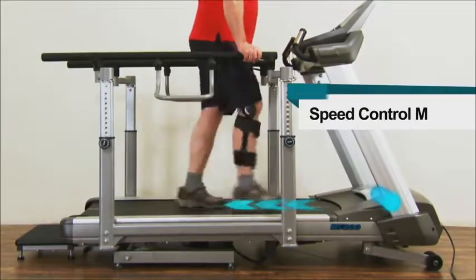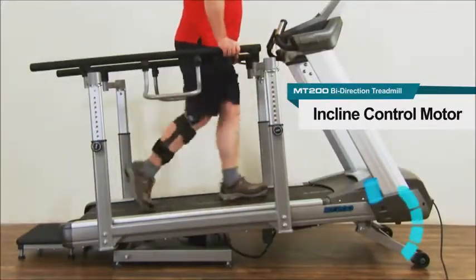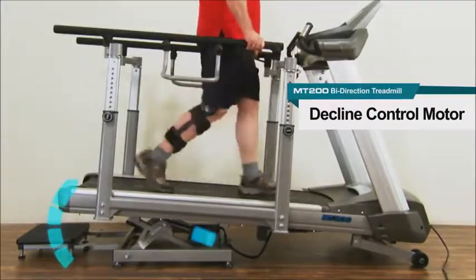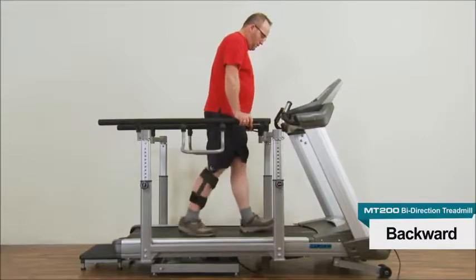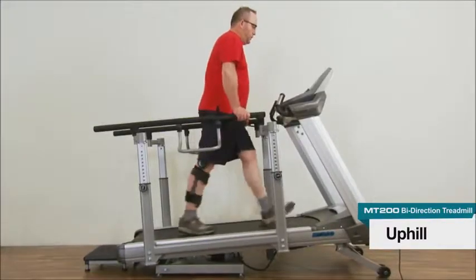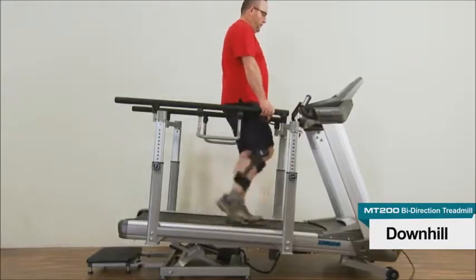The MT200 has three motors: one for forward and reverse speed control, one for incline from 0 to 15 percent, and one for decline from 0 to 10 percent. The three motors provide a variety of environments for training different muscle groups. Users can walk or run downhill or uphill in either the forward or the reverse direction.